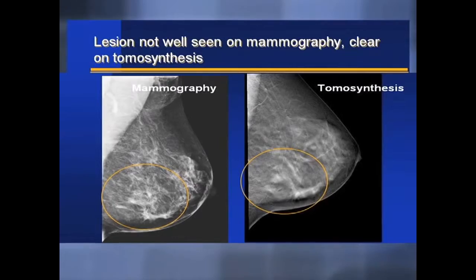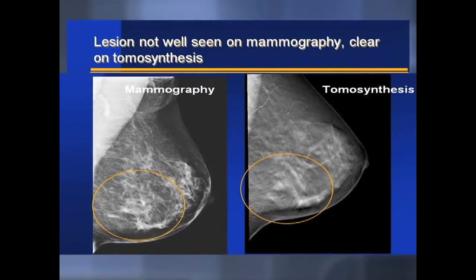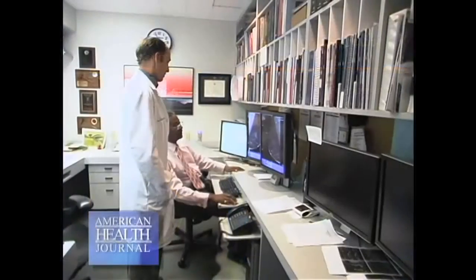Digital breast tomosynthesis is a technology that was first developed around 2006, and it is a method by which we can reduce superimposition in the breast. One problem that we have in imaging breasts, or really with any radiographic technique such as mammography, is superimposition.